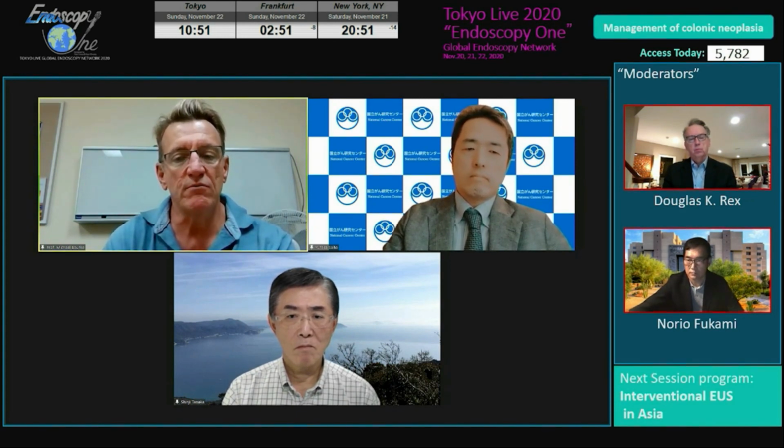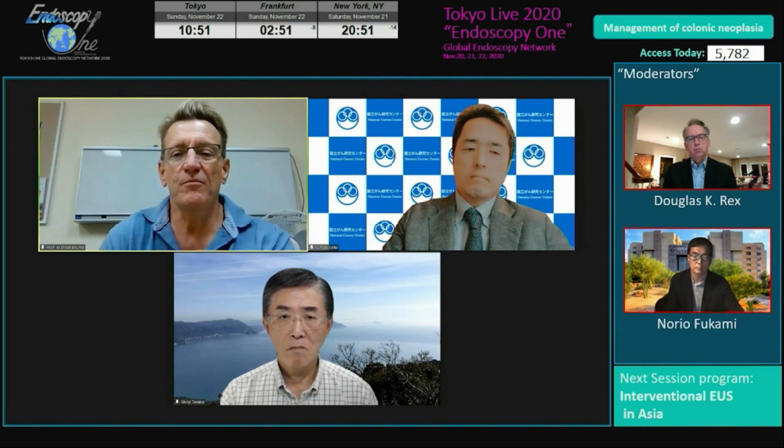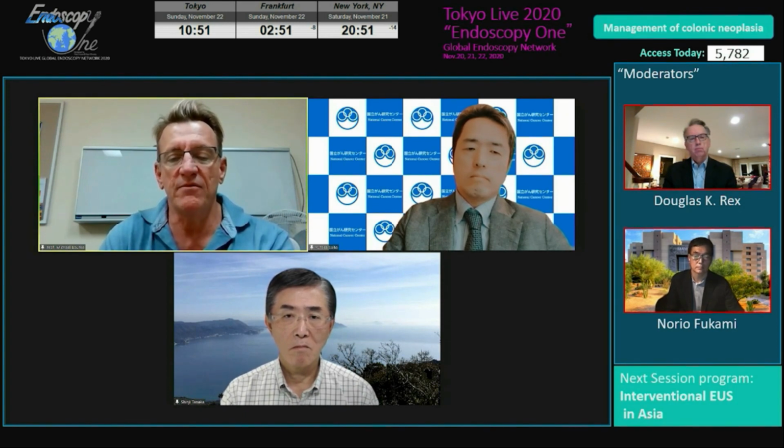And once we resect the lesion, it might happen once or twice a year that we say, gee, I didn't expect that. It's really unlikely that we're surprised by the pathology. But we did for a very long time pin everything so we could evaluate depth of invasion and so on. That's very important. We're never surprised then. Yeah.